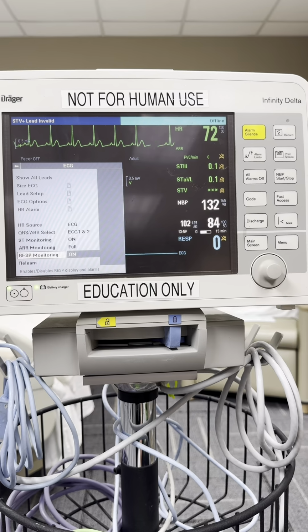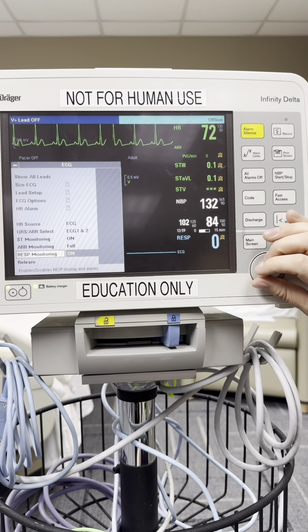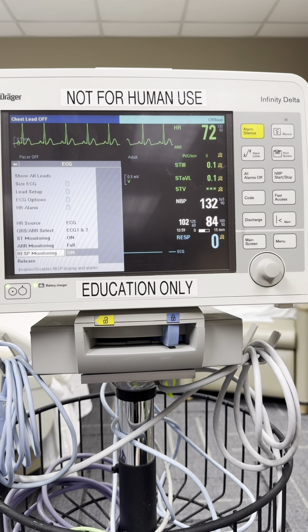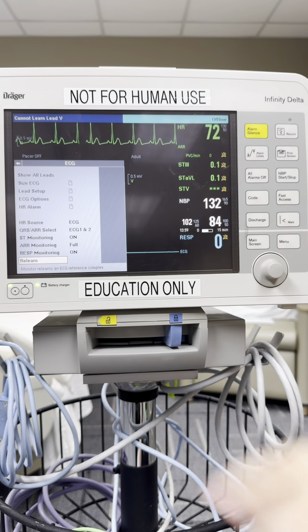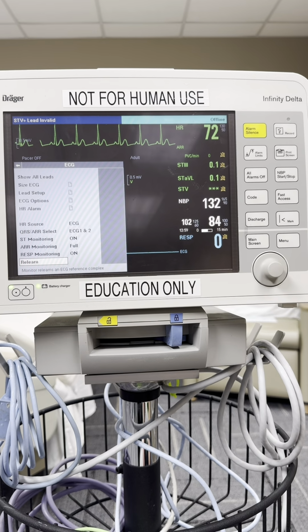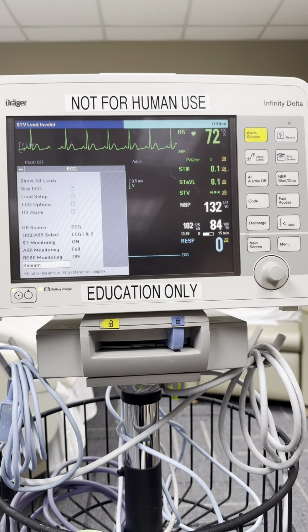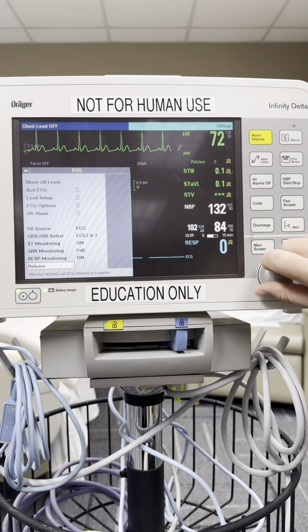The respiratory rate is actually monitored by the movement of the leads on the chest. So that's why this number can be off sometimes if the patient's pretty restless, it interferes with the up and down movement of the chest. Down here at the bottom is the relearn button. You should be relearning your patient. The recommendation is every 8 hours, but at least once a shift, or if you change the patches on them, this can help with any artifact or any trouble reading their rhythm.